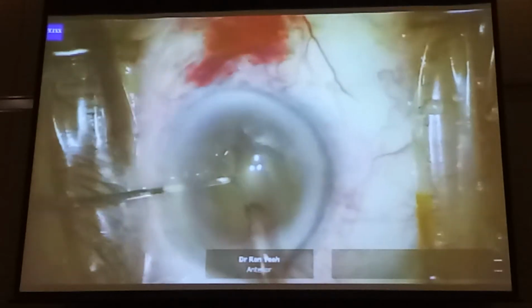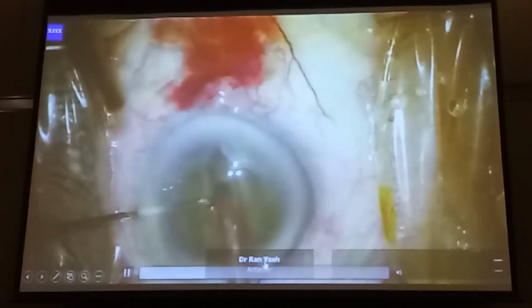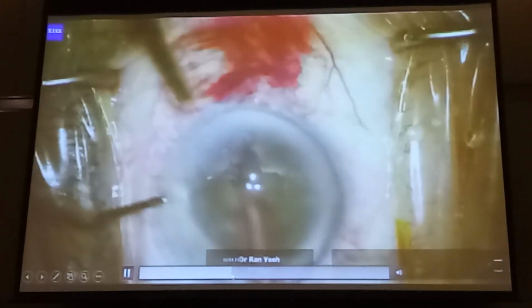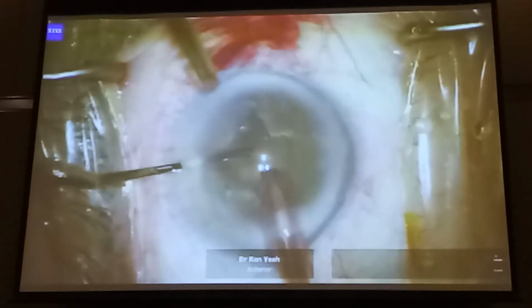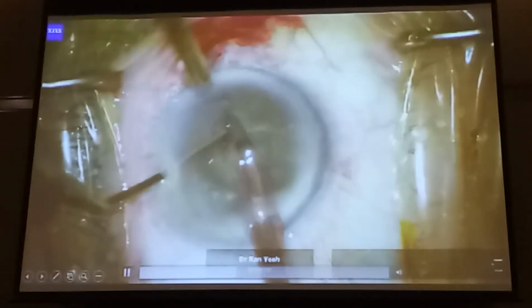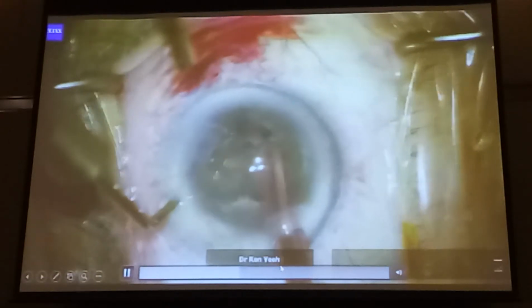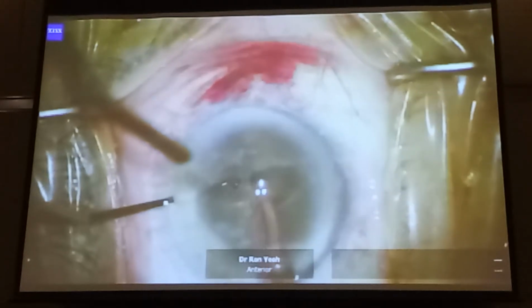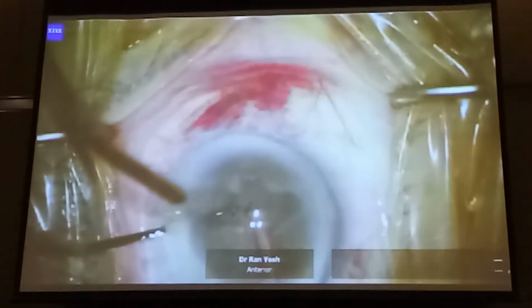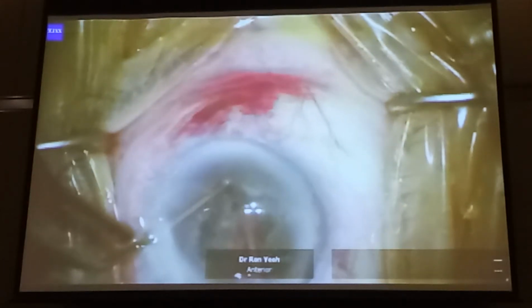Well, that doesn't crack, so let's rotate it and try somewhere else. So that's what she does. She tries to make it deeper, goes somewhere else, and then she's rotated it a bit now, trying to get it deeper to crack, and still it won't crack. There you go, she's trying again, another time. That got a little bit. Okay, and then she tries to remove it, but because it's not free in the other quadrants, it just will not come.